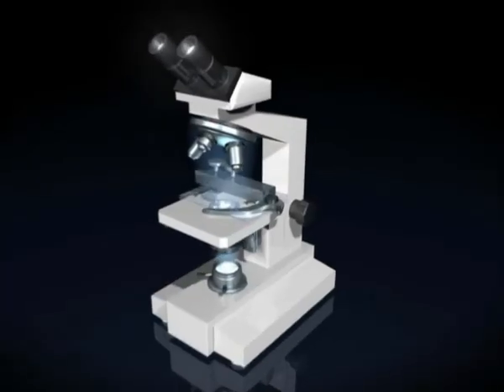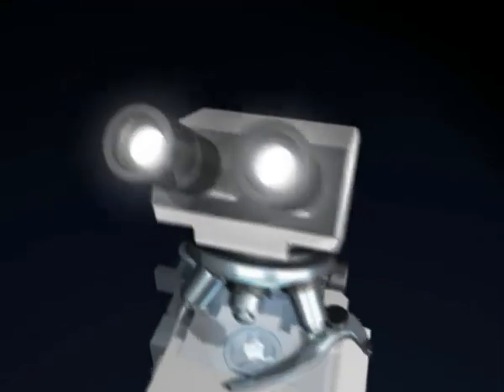The final sample obtained is evaluated under the microscope and finally the sperm is stored in a test tube.